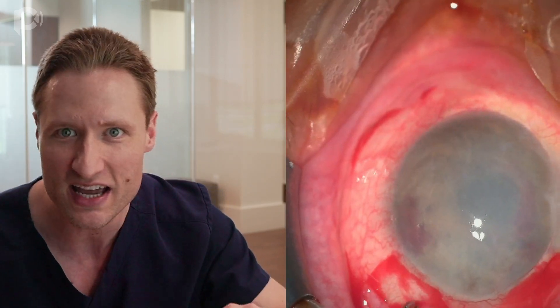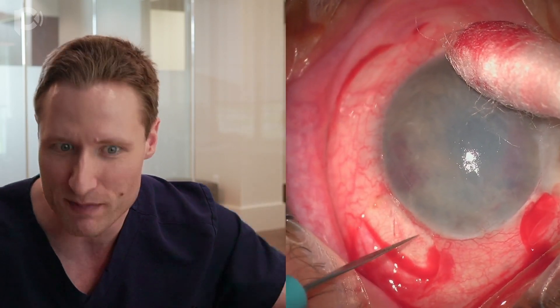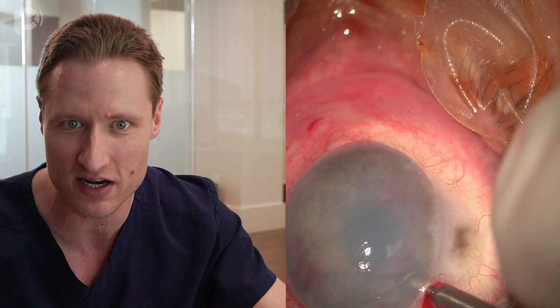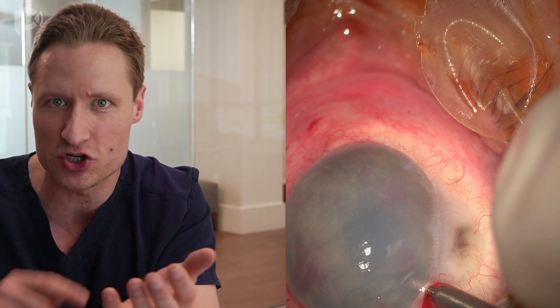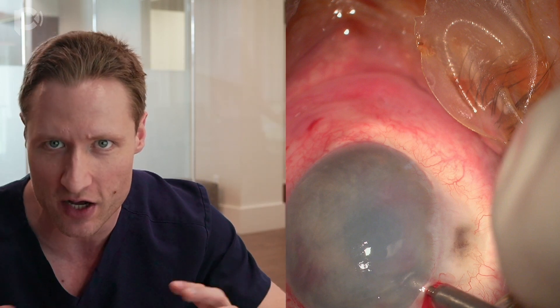This is how I'm going to create a deep chamber — I'm making a small peritomy infratemporally. I'm a left-handed surgeon, using some cautery for hemostasis, and with my dominant left hand I'm making a triangular partial-thickness scleral flap, dissecting it up with a crescent knife. This is almost like doing a trabeculectomy. I'm making a sclerostomy with a 15-degree blade, then doing a vitrectomy with no AC maintainer — just to deepen the AC. The vitrectomy probe is insinuated behind the iris, kept in the pupillary aperture so I can watch the handpiece mouth and avoid incorporating surrounding tissue.